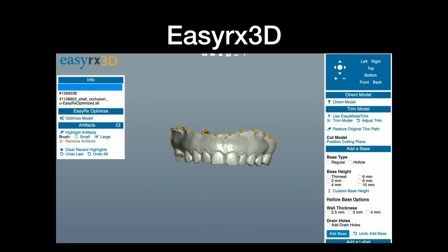And this is the screen you get. This is a web browser. I'm going to demo this in a little bit. It's internet based. Maybe I'm the only nerd that likes this, but I think it's cool. All the editing and resolution stuff is done on their servers, and you're just seeing a view of it on your side. So it's kind of a live stream of your edits.